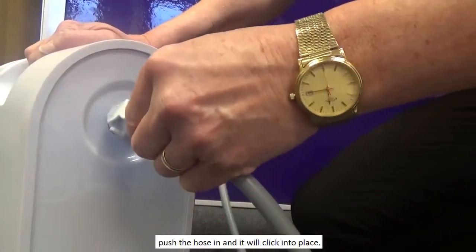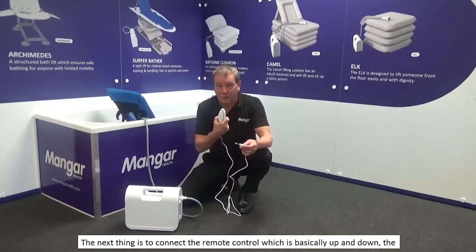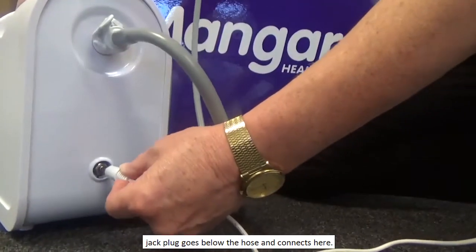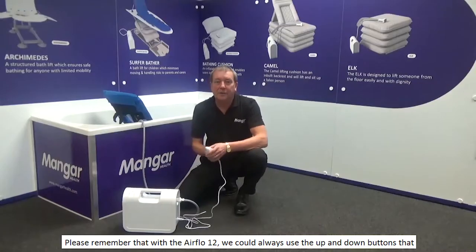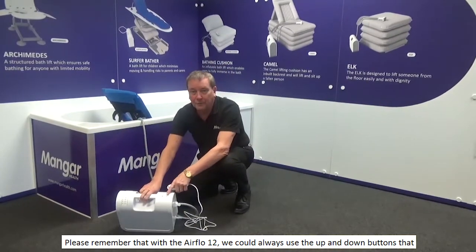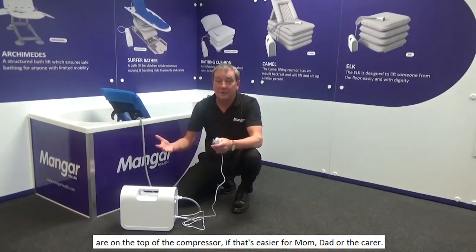Push the hose in and it will click into place. The next thing is to connect the remote control, which is basically up and down. The jack plug goes below the hose and connects here. Please remember that with the Airflow 12, we could always use the up and down buttons on the top of the compressor, if that's easier for mum, dad or the carer.